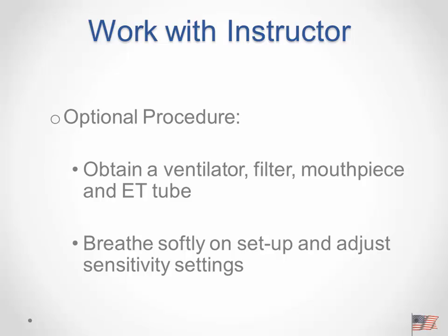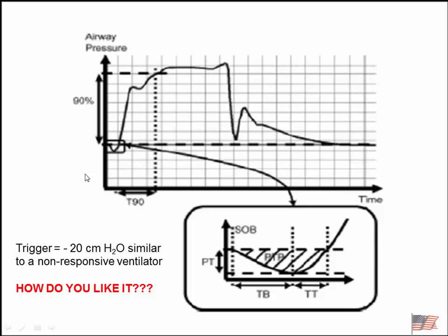If you want, we can get you a filter, and you can put yourself on the ventilator and feel what it's like to have different levels of trigger present. So we can put you on -20 trigger, and you can see how uncomfortable that truly becomes.